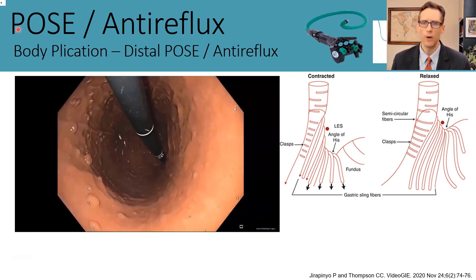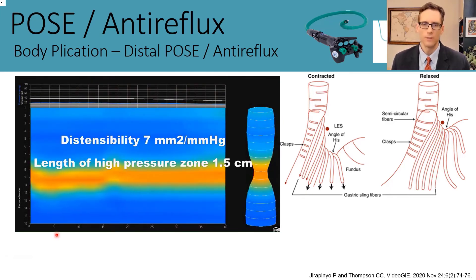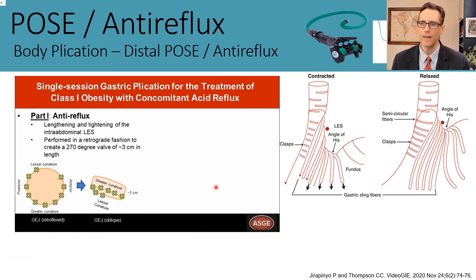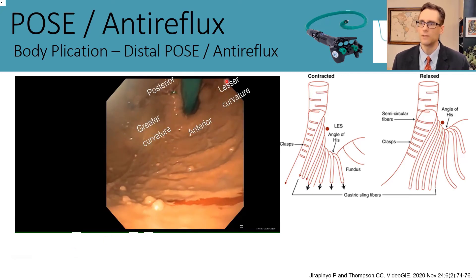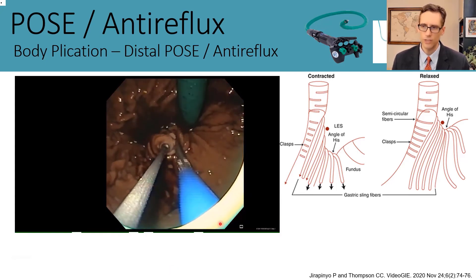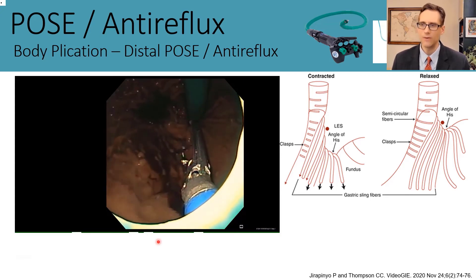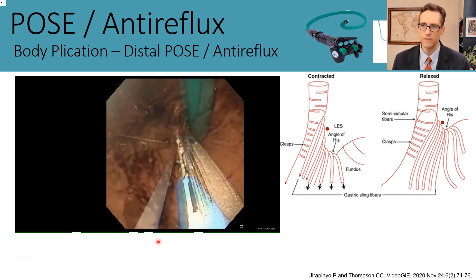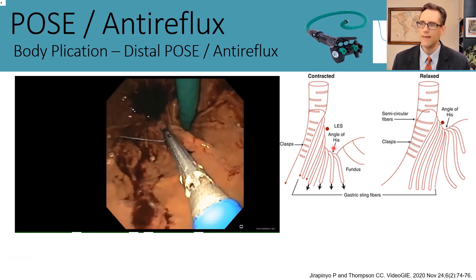Finally, we have a relatively novel procedure: POSE with an anti-reflux component. Upper endoscopy shows a Hill grade 2 hiatus, and EndoFLIP shows a DI of 7 with a high pressure zone of about 1.5 centimeters. We start with the anti-reflux component, which has plications aiming to elongate the intra-abdominal portion of the LES while also reducing its width. Working in retroflexion, our first plication pulls the LES down and elongates the intra-abdominal segment, aiming to not only elongate the intra-abdominal esophagus but also make the angle of His more acute.